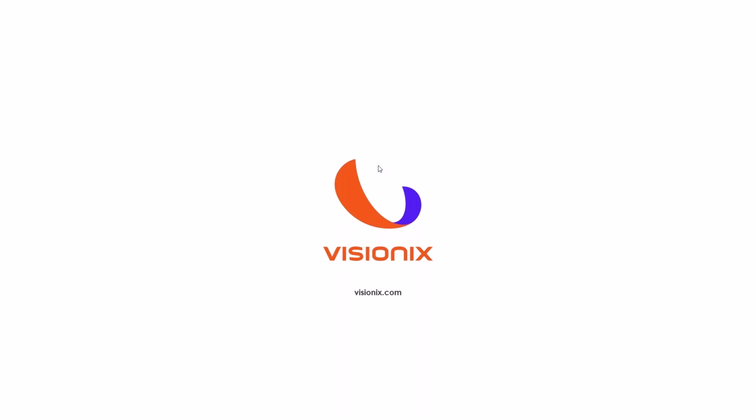Question here about indications for an OCTA. The technology, as you mentioned, has been around for 5 or 6 years now. Are the indications where you're ordering a scan increasing over time? I think they are, yeah. We're utilizing this more and more. We started with macular degeneration, really helping us differentiate between dry and wet. And then diabetes, we started adding that in there.